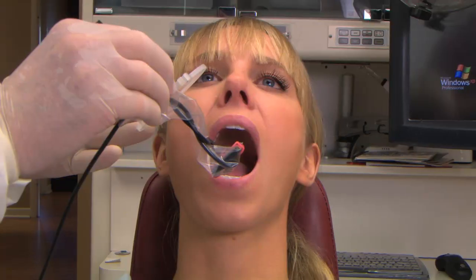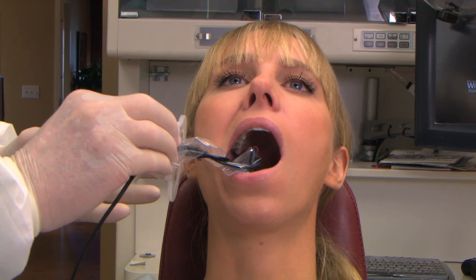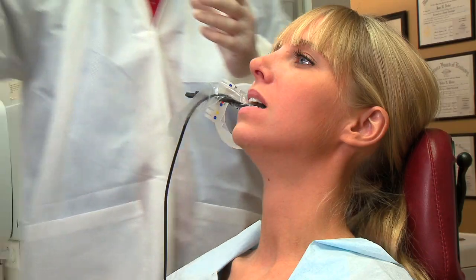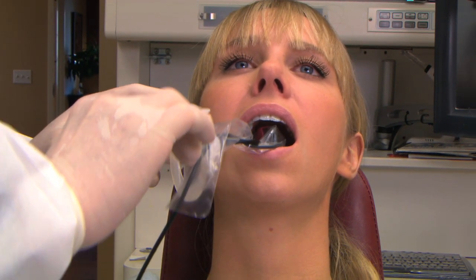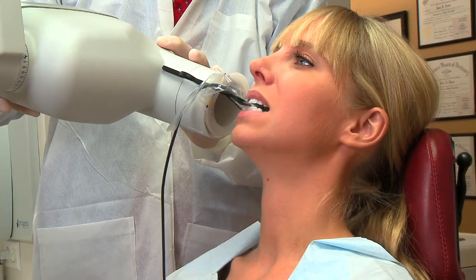Go in on a 45-degree angle into the lingual side of the tongue. Place the sensor, turn, and push to the midline. Tell the patient to close gently. Align the cone with the aiming ring and take the X-ray. Move forward to the premolar position and tell the patient to close gently. Align the cone with the aiming ring and take the X-ray.